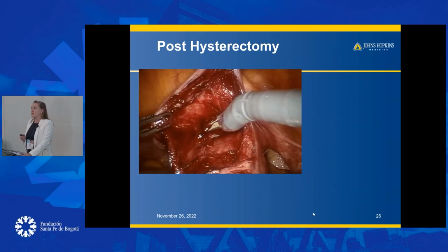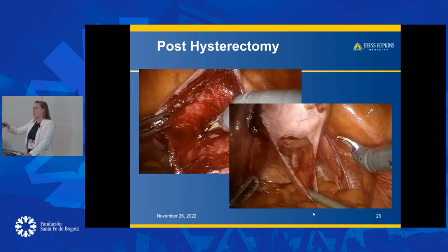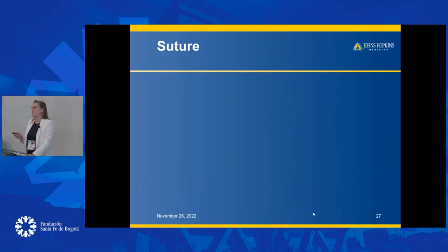As I highlighted from the video, the post-hysterectomy dissection is a little bit different. We don't actually take off the peritoneum from the actual cuff because that's where a lot of scarring is, and that's where you're going to make some vaginotomies. So try to just make a separate incision over the anterior plane and then the posterior plane, and that works very nicely. So suture. I talked about the V-lock. It's a really great tool to speed things up.